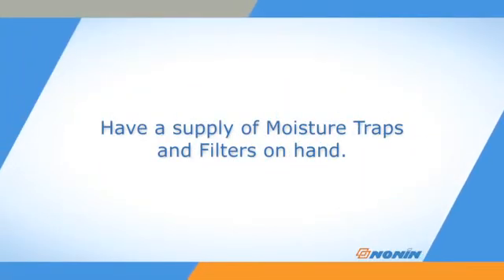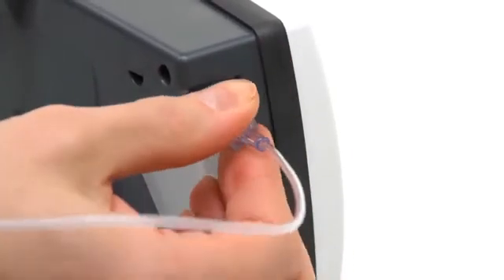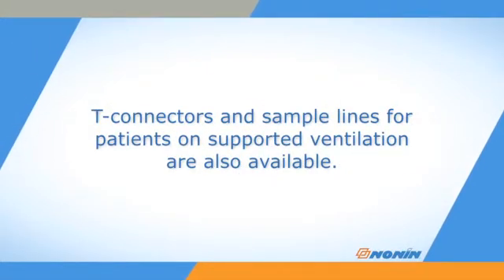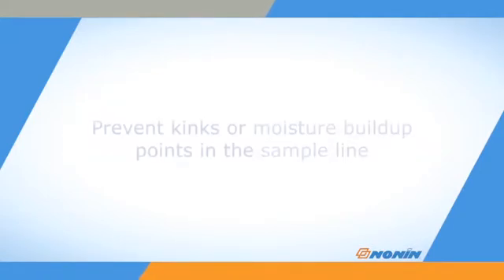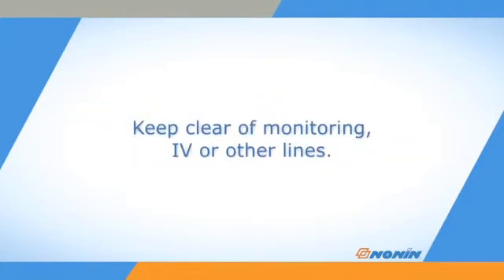Have a supply of replacement moisture traps and filters on hand. Three sizes of nasal cannula are available for adult, pediatric, and infant use. Place the nasal cannula and snugly attach the sample line to the moisture trap using the luer lock stem on the trap. T-connectors and sample lines for patients on supported ventilation are also available. We also recommend using Nafion tubing for ventilated patients receiving added humidification to reduce moisture buildup. Proper sample line placement and routing help prevent kinking, occlusions, or moisture buildup. Keep the sample line clear of monitoring, IV, or other lines attached to the patient.